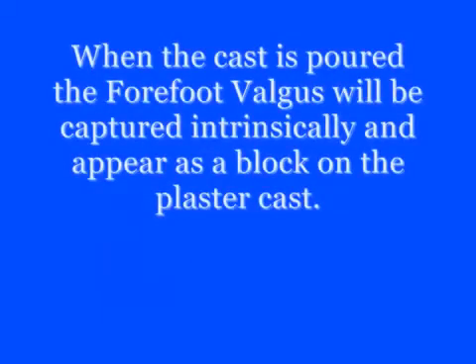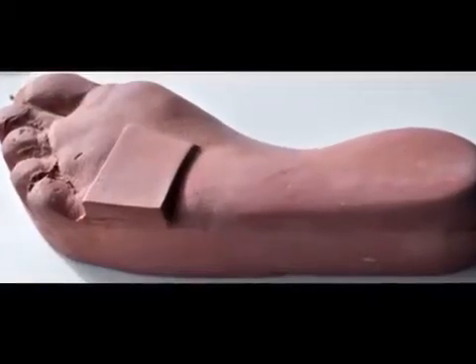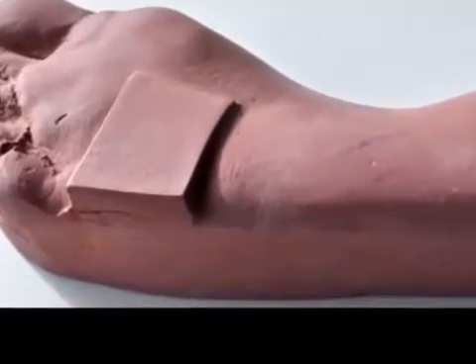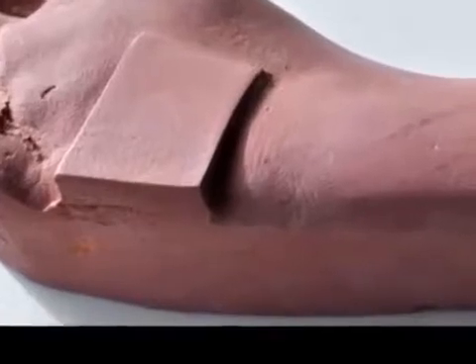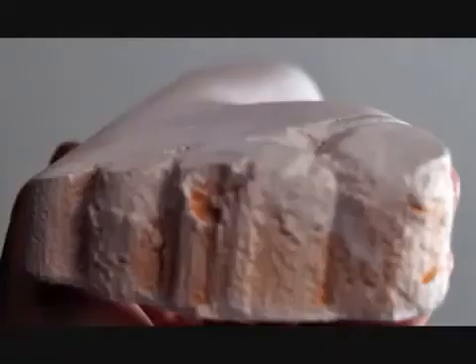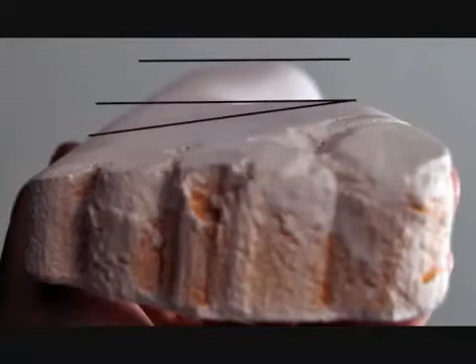The poured cast will now capture the forefoot deformity in the plaster. In this cast, the forefoot wedge or block has filled the gap between the forefoot and rear foot planes. The laboratory technician can now remove the forefoot block to reveal the foot shape and the gap that will need to be filled with the orthotic device.